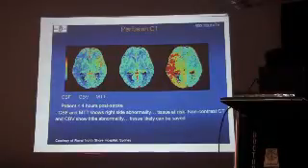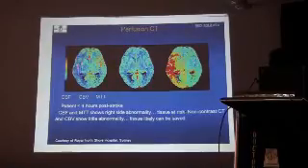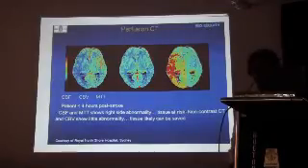So this patient is taken from this hospital. A patient 4 hours post-stroke, cerebral blood flow and mean transit time, and the right-sided cerebral blood flow, mean transit time. So right-sided abnormality, tissue at risk. Non-contrast CT and cerebral blood volume. This one, cerebral blood volume, shows little abnormality. So tissue can be saved.